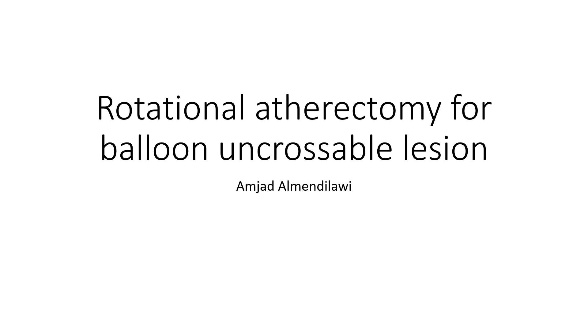Hello, this is Amjad al-Mandalawi from Baghdad, Iraq, presenting a case to show how to use rotational atherectomy for a calcified lesion that could not be crossed by balloon.